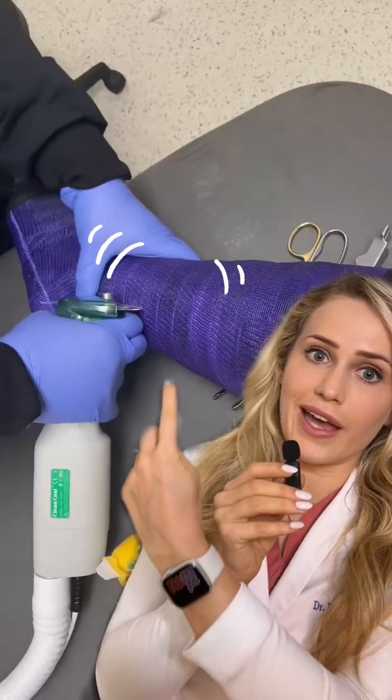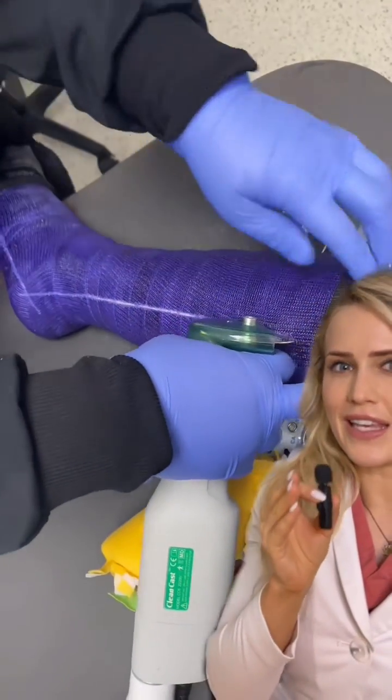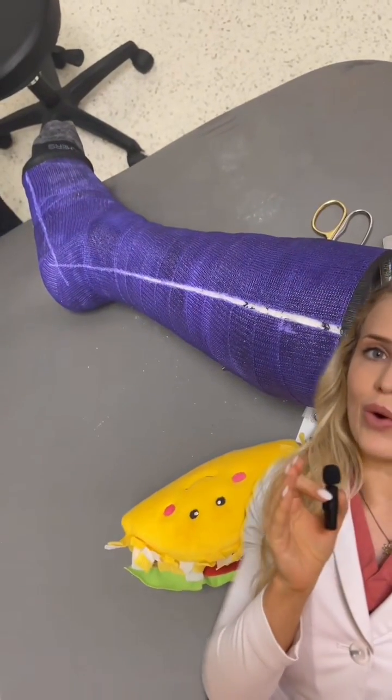So it will cut through the cast right there, but it won't cut your skin. You might feel heat, a lot of vibration, and it's going to be very loud, but it won't cut your skin.